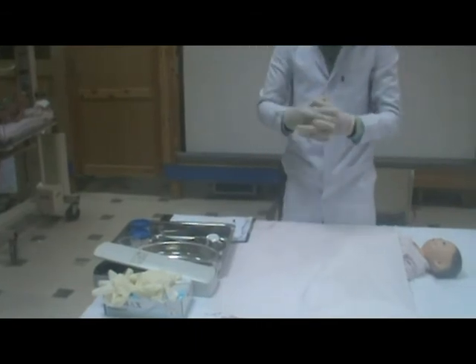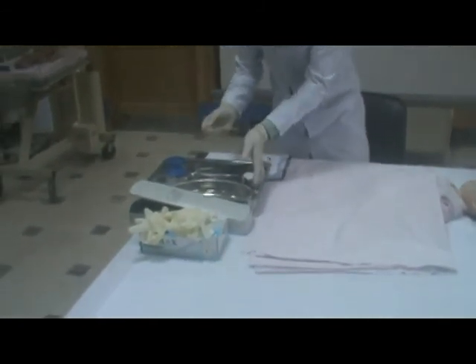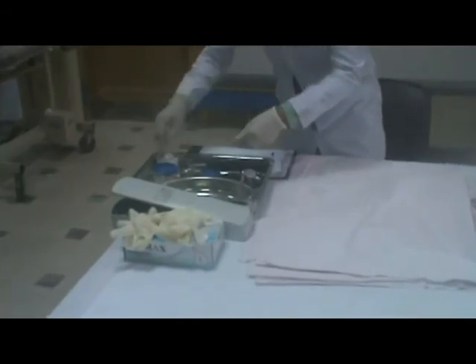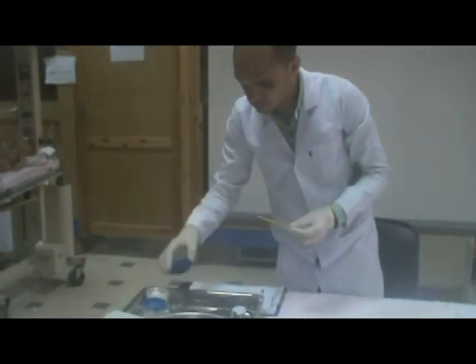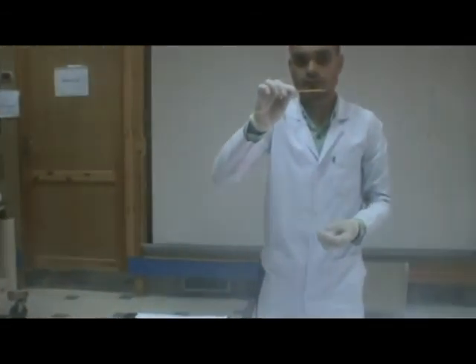Clean the thermometer with an alcohol swab to reduce transmission of infection. Check the thermometer to see that the reading is down below 35 Celsius.